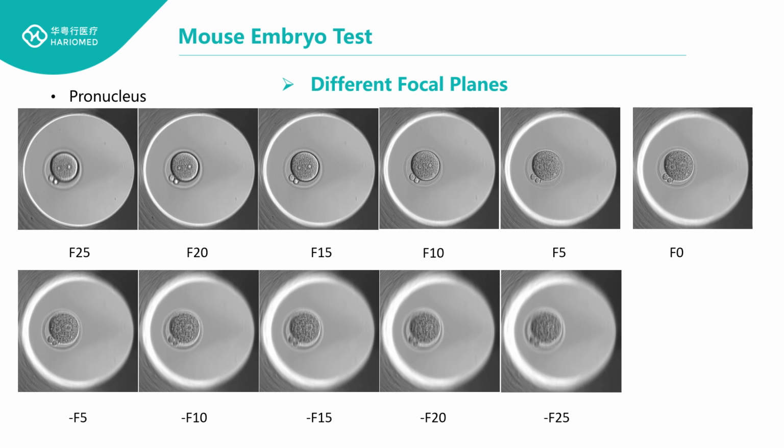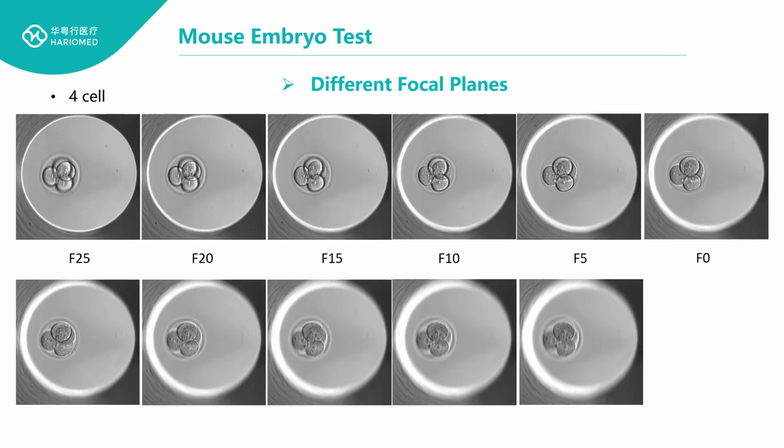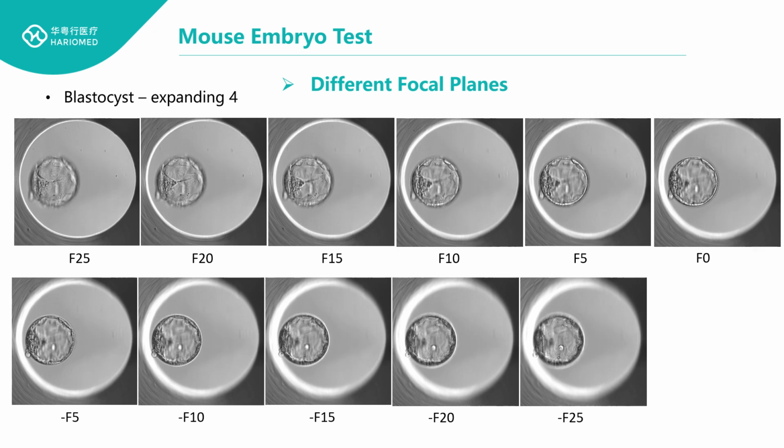And then for the time-lapse incubator, we can see each embryo within different focal planes with pronuclear stage, 2-cell stage, 4-cell stage, 8-cell stage, morula, and blastocyst.